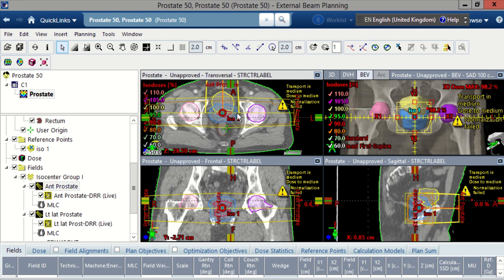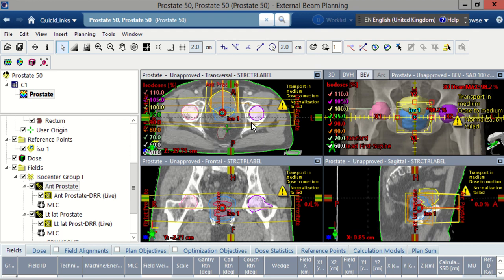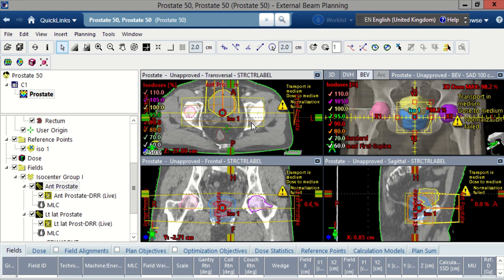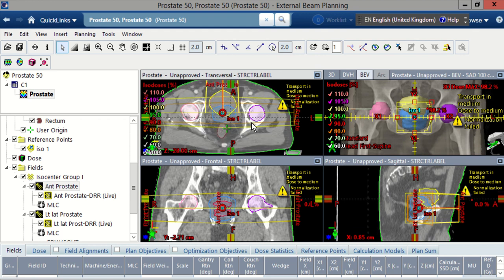Once we've completed that, we can then go into this part of the screen where we can apply the radiation beams that we want to treat with, and we can add different accessories to allow us to manipulate the dose however we want, using the physics knowledge that we've learnt. If I scroll up and down, you can see all the different structures.